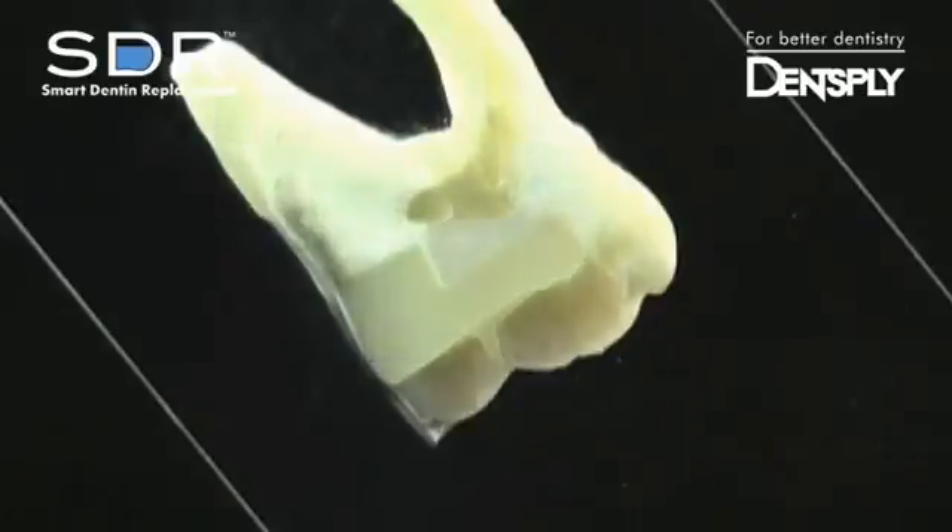Self-leveling and bulk fill — a revolutionary posterior flowable composite, any way you look at it.